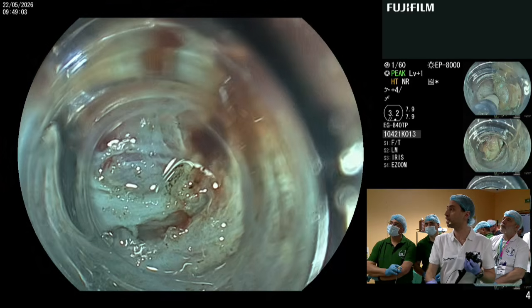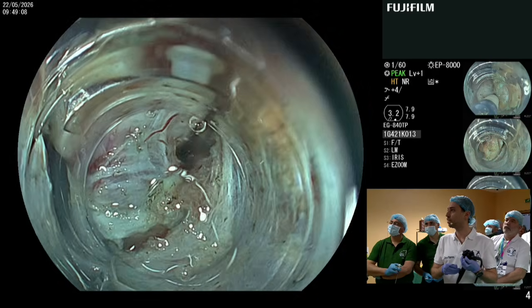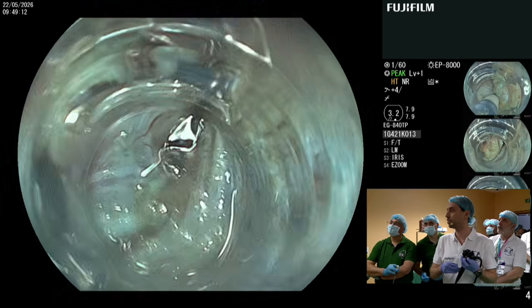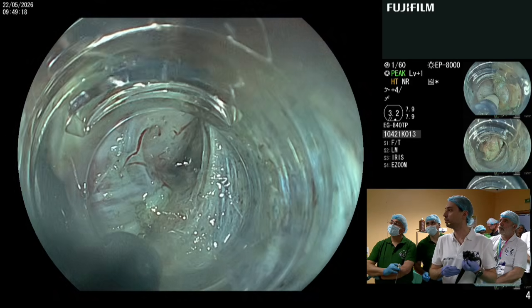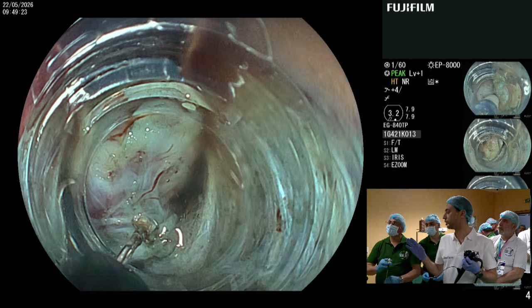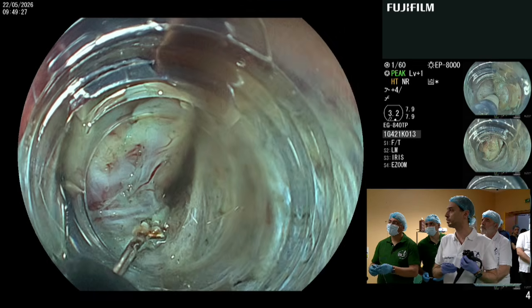At this point, I have changed device. I will use the hook knife, and we will probably induce a perforation or intermuscular dissection. Let's see. So needle out. Okay. You can rotate the knife. Please rotate the knife at, yes, there.